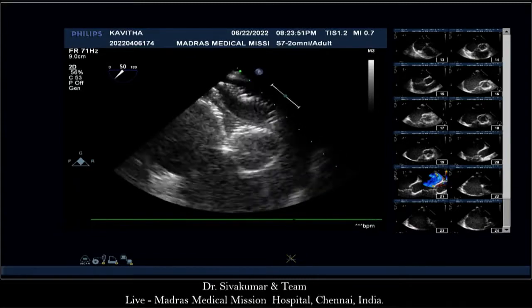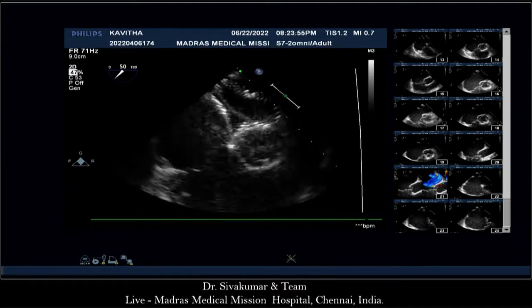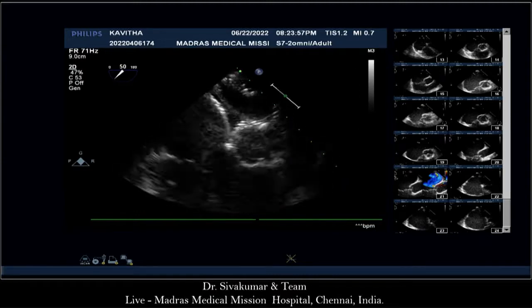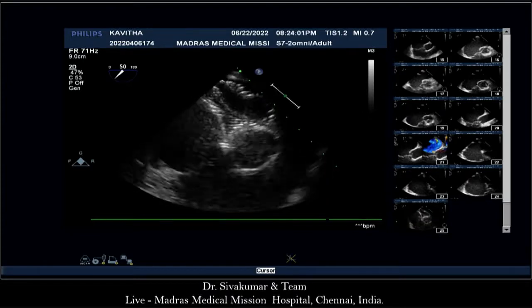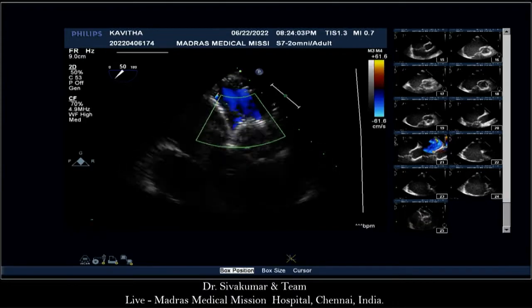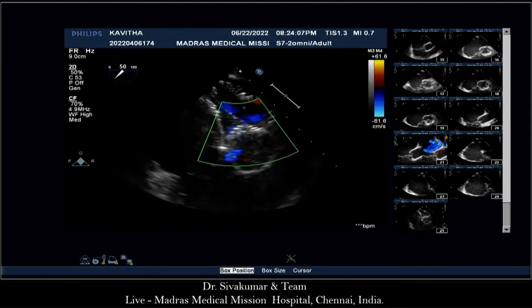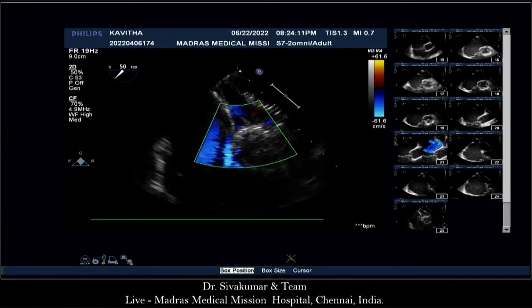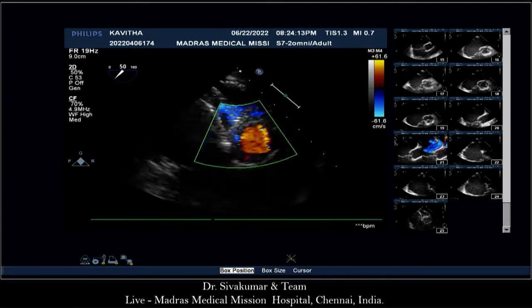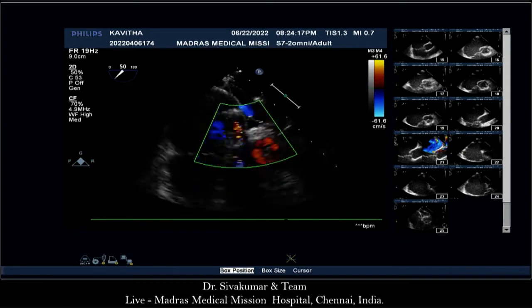Nicely pull it out. Let's see the 4-chamber view, see the mitral valve. So the anterosuperior margin is slightly flared. Come out, Srija. Okay, start coloring from here, only the anterior margin. Now make it narrow. Okay, keep progressively pushing inside. Perfect. Keep on going inside. I'm going in. Now we are going to get the mitral valve.